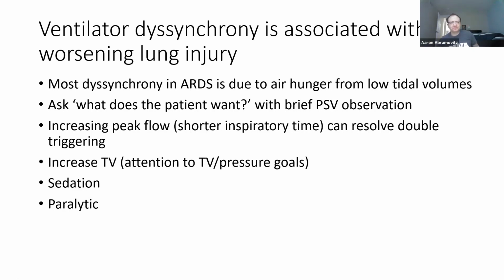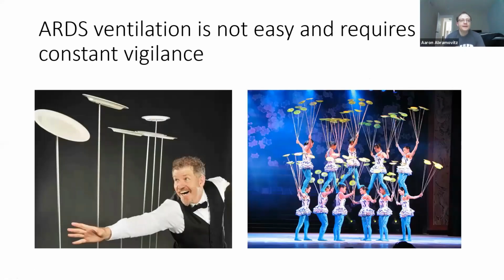And finally, if dysynchrony is a very serious issue, you can always paralyze. And ARDS ventilation is not easy and requires constant vigilance with all of these conflicting but very important goals. So regular ventilation is like this guy, and ARDSnet ventilation is like these people. That's pretty cool. Those are spinning plates, for those who don't know.